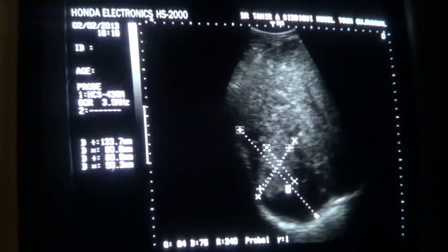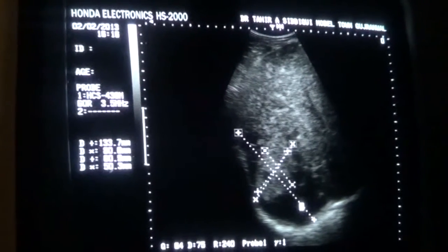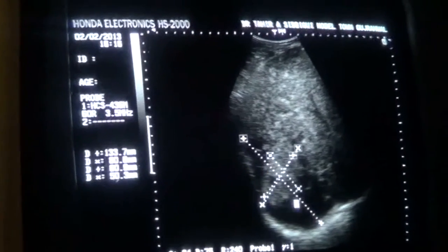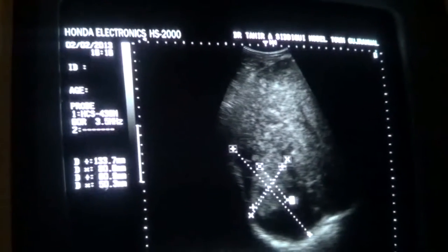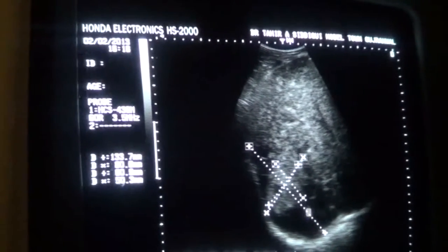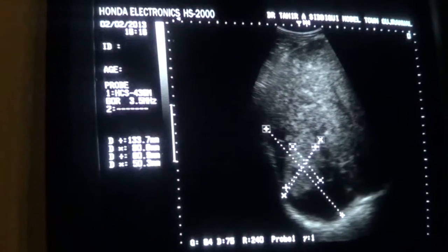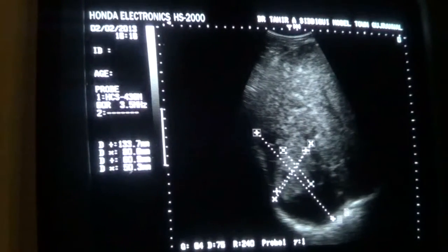and its medial as well as lateral and posterior surface is seen containing fluid. So there is fluid alongside the inferior, lateral and medial margins of this solid focal mass lesion in the cirrhotic liver, right side. And this is the diaphragm, right hemidiaphragm.